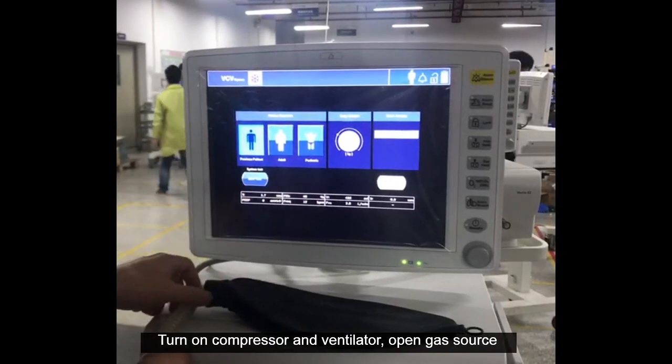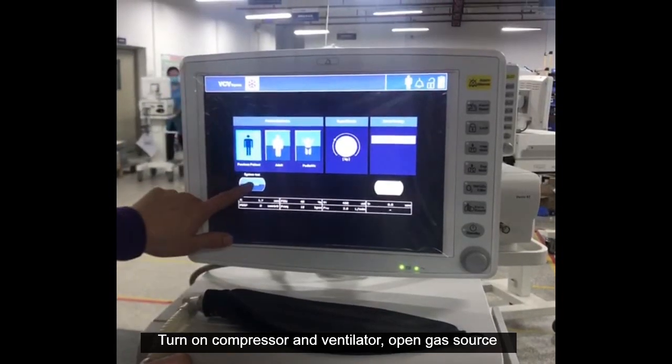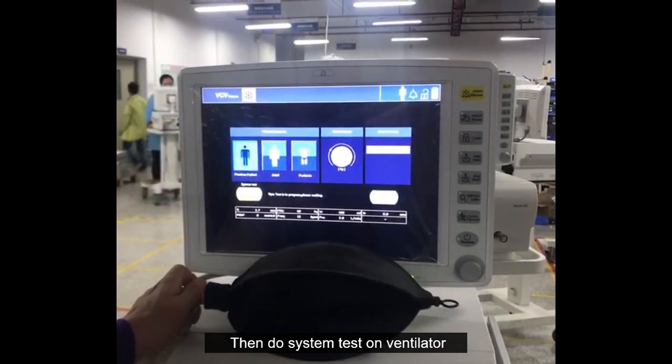Turn on the compressor and ventilator, open the gas source, then perform a system test on the ventilator.